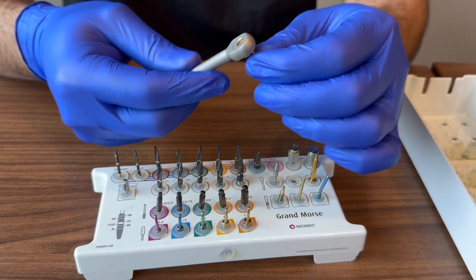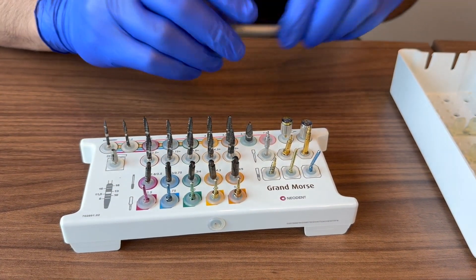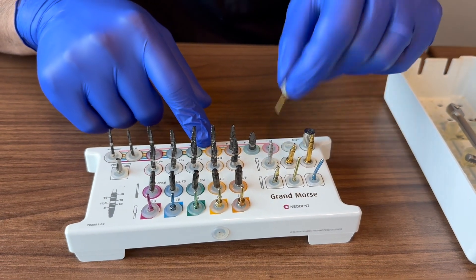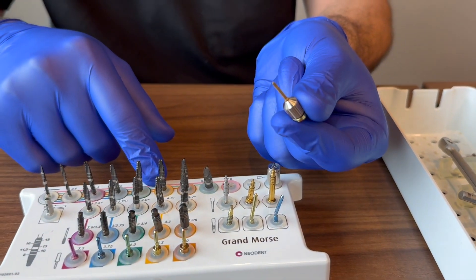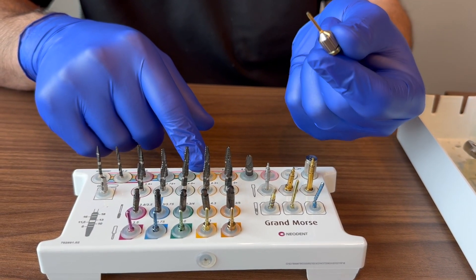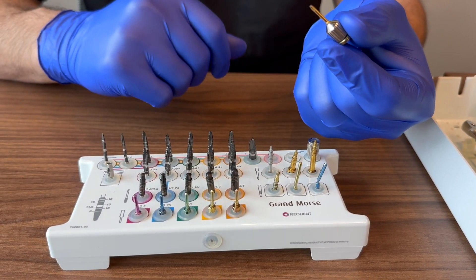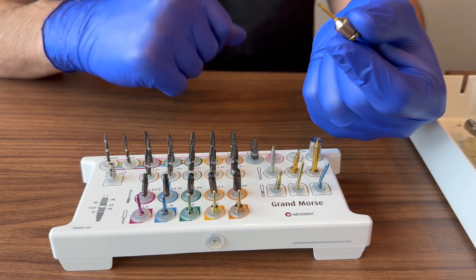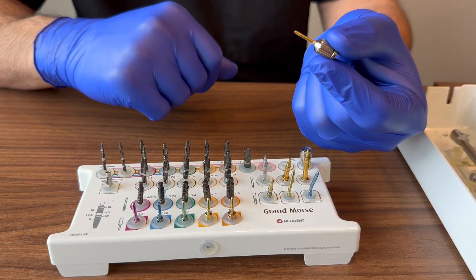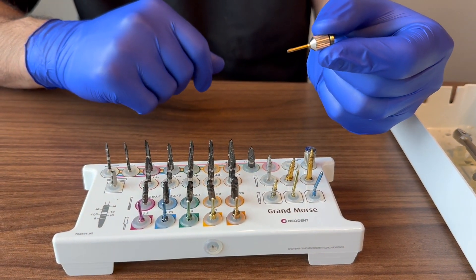Once the implant is in, the next thing you'll need is the prosthetic driver, which attaches to either your healing collar or your cover screw. Generally, if you achieve a torque value of 35 Ncm or more, it's safe to place a healing collar. Below that, or if you have a spinning implant, it's safer to place a cover screw and bury the implant.